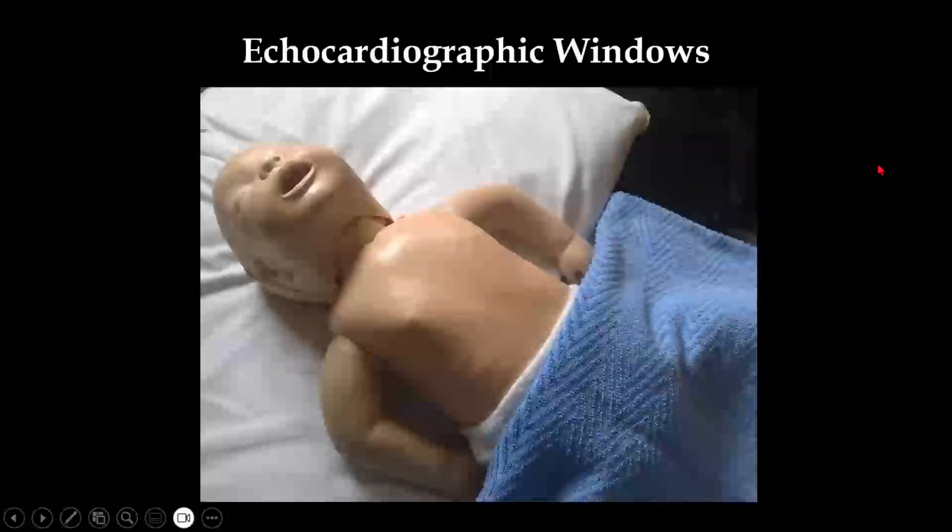So we come down to the windows, through which we will see the various structures. If you get trained in pediatric cardiology or with adult people, they always start with the subcostal windows, and that approach is scientifically correct. But in neonatology, if your babies are on CPAP or in room air, starting with the subcostal views directly irritates the baby, the babies start crying, and you will not get proper views. That's why we tend to do the subcostal views at the end.